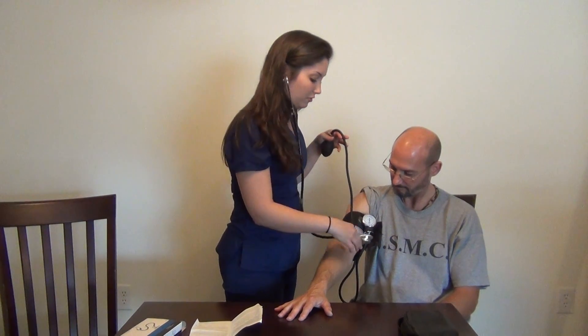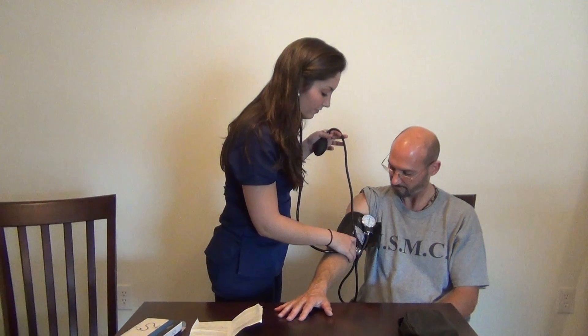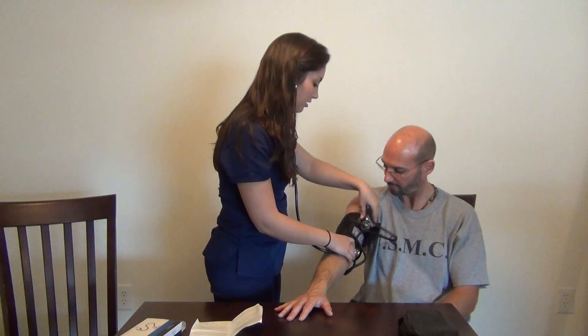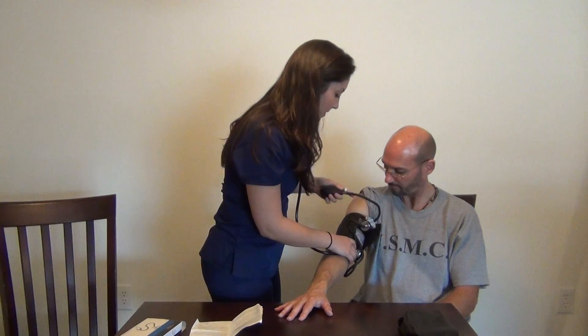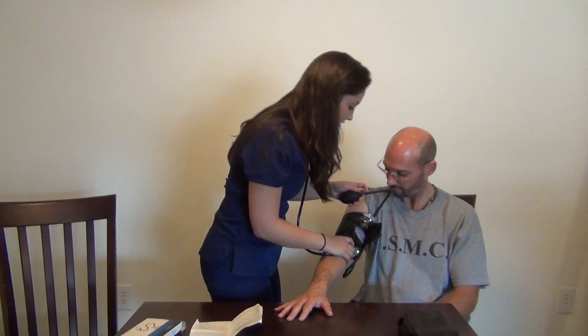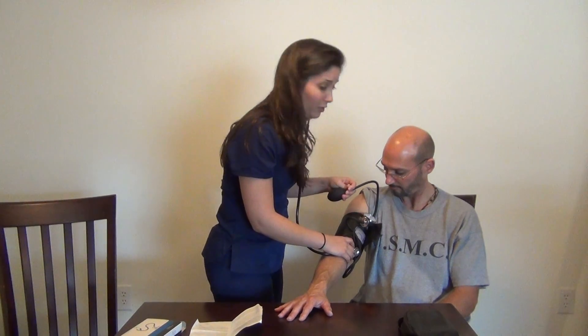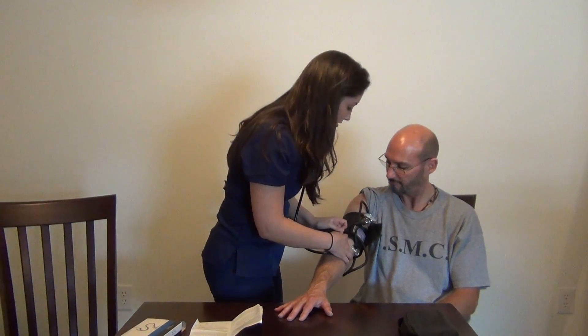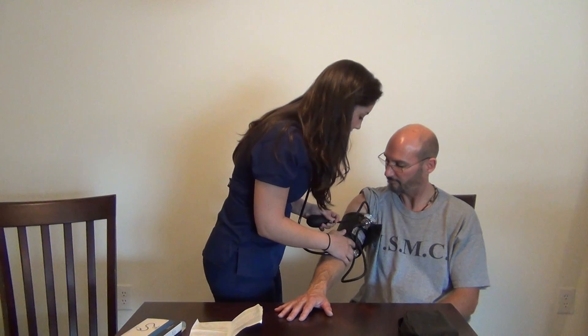Place the stethoscope right there on the brachial artery. You probably won't hear anything until you start to let the inflation go. Position it and make sure it's tight, inflate to 180, and then very slowly release the valve. It might take some time to get it right without releasing it all the way. The very first pulse beat you hear is going to be the top number of your blood pressure — the systolic blood pressure reading.